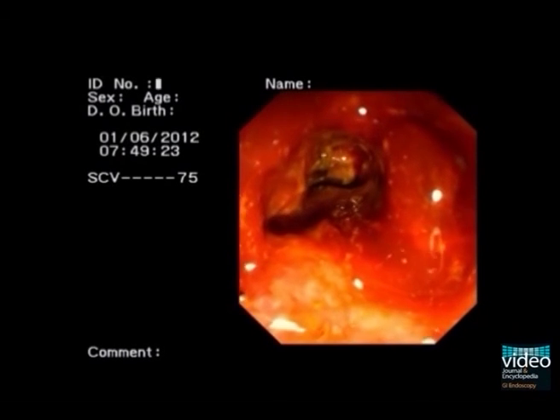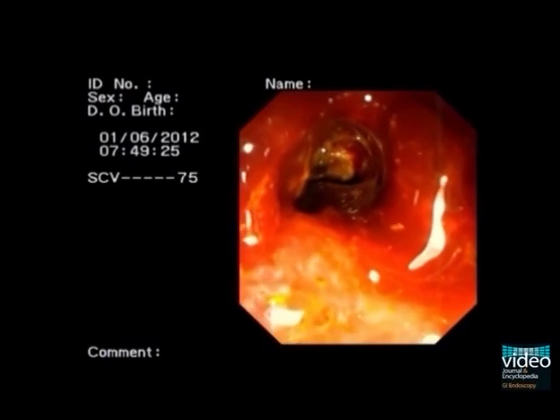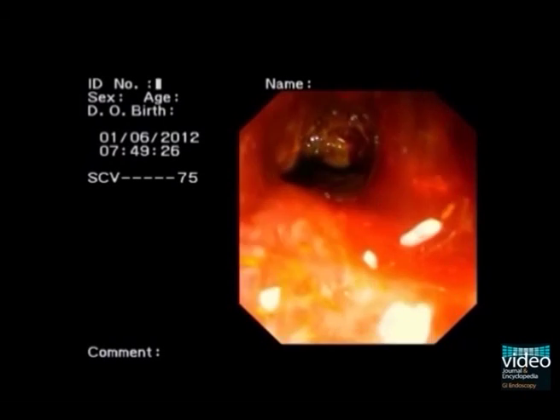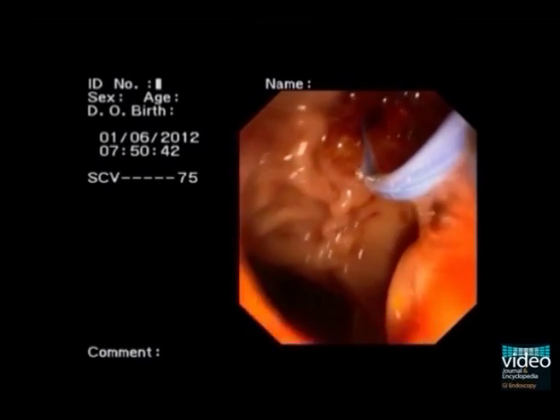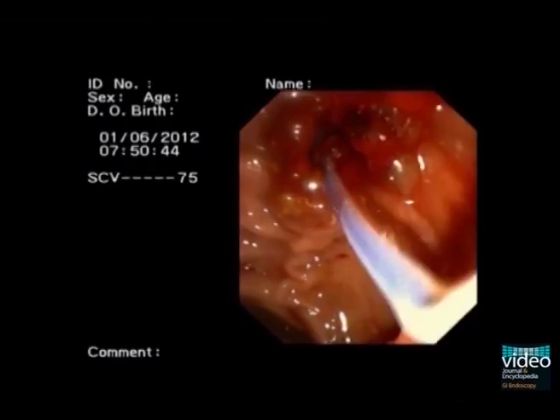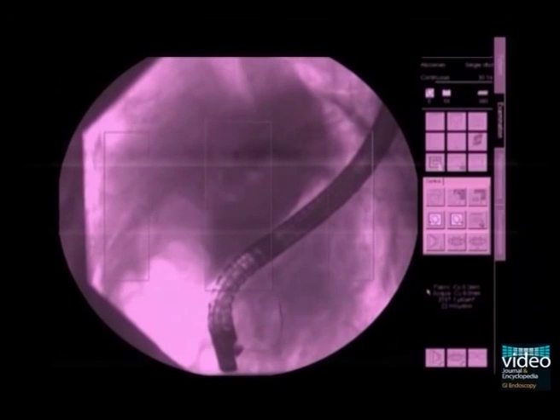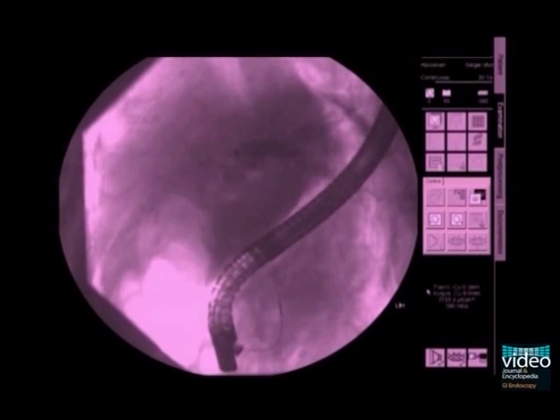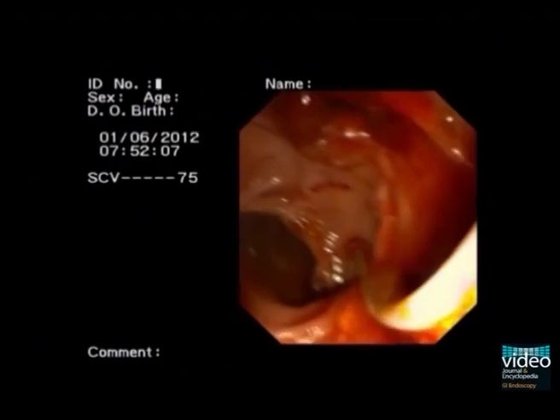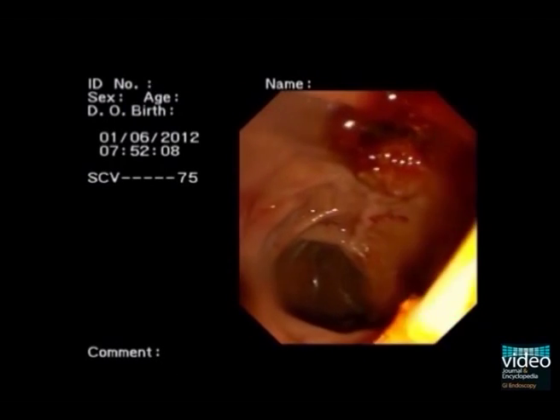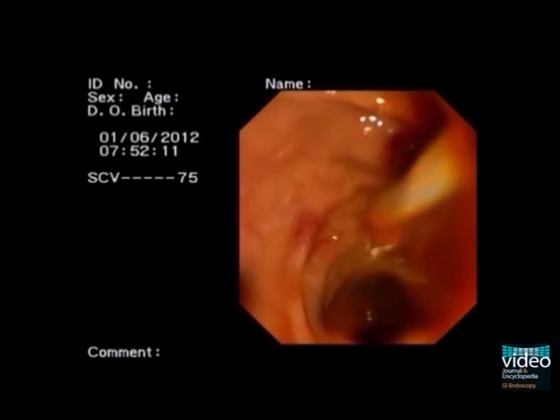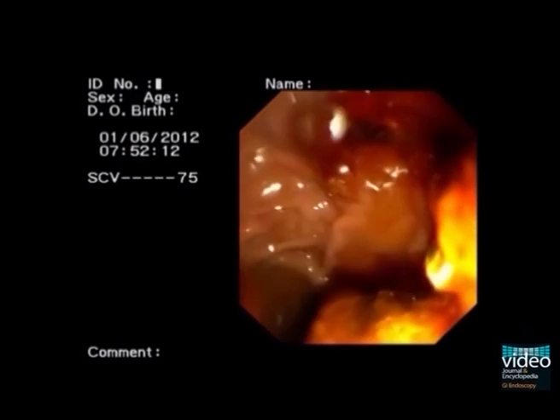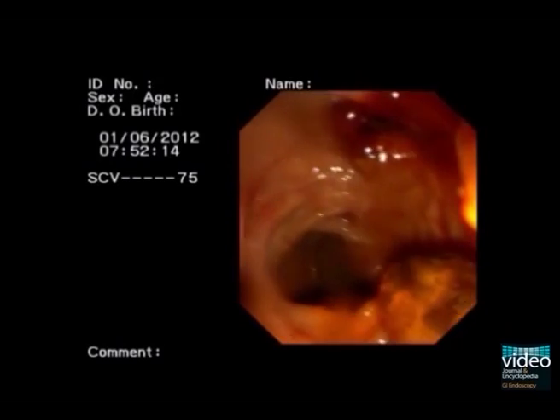A basket is inserted and is fully deployed into the dilated CBD. The basket is being pulled out together with a stone. The stone can be seen through the dilated ampulla.